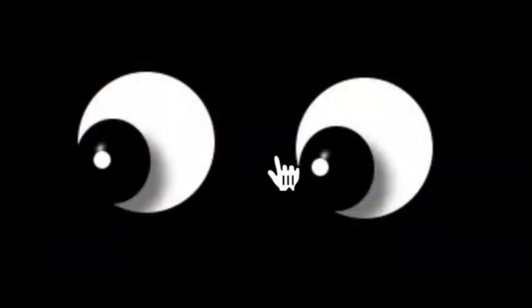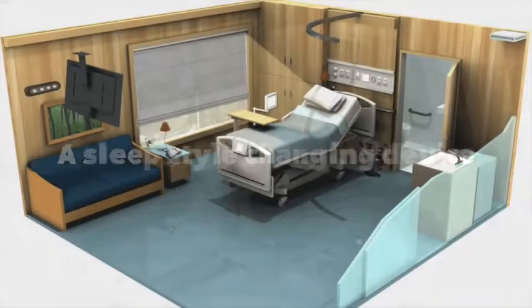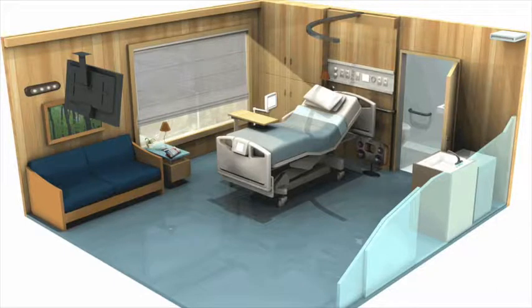The only limitation is that the patients must be able to control eye movements. Introducing Sleep Mode BCI, a sleep-style changing device for quadriplegic patients. Here is the room we designed that contains our BCI device and its multiple features.